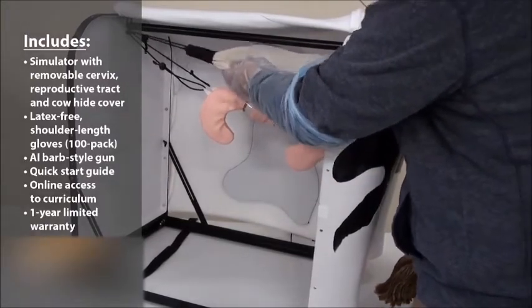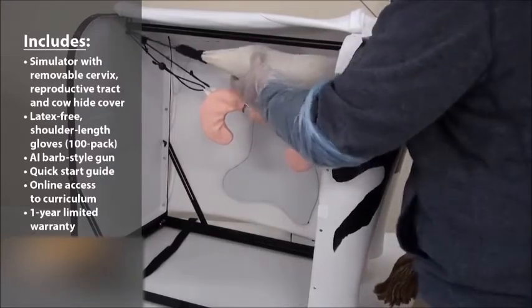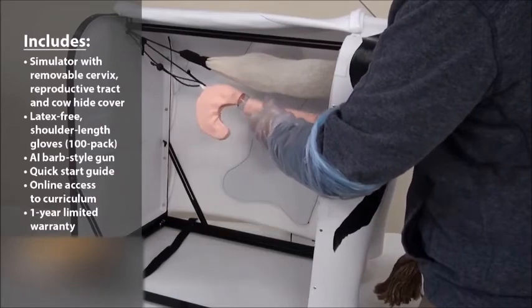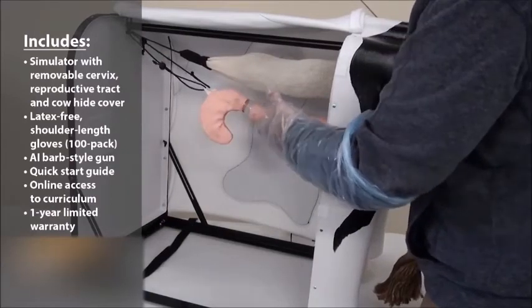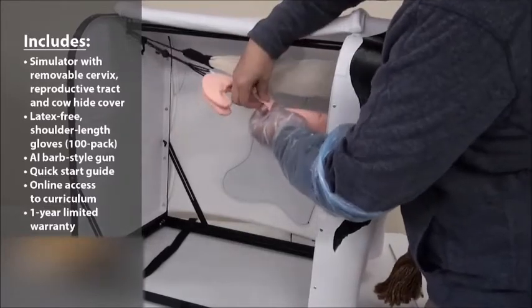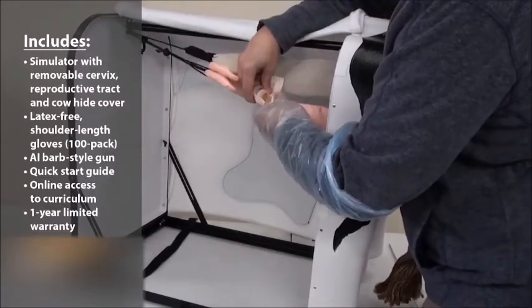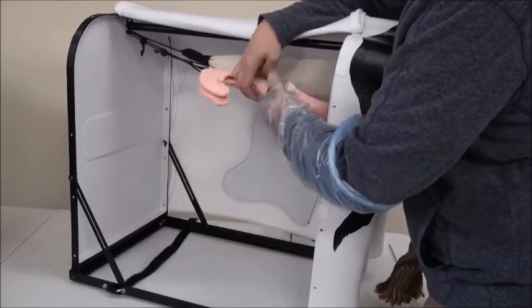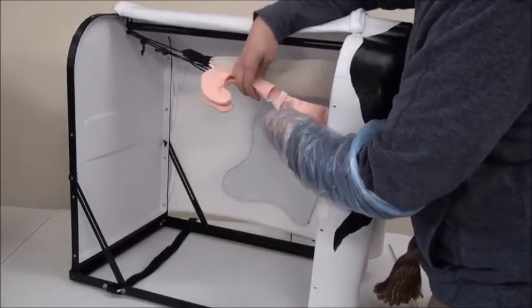The pliable rectum is able to move and be positioned in space along with the reproductive track, allowing you to see what's happening inside as you go. Inside the reproductive track, you can actually remove this piece to show your students how the cervix works and the different rings inside — it's a removable piece.